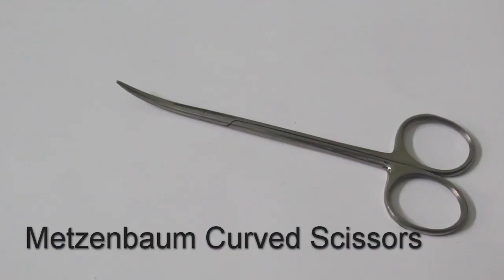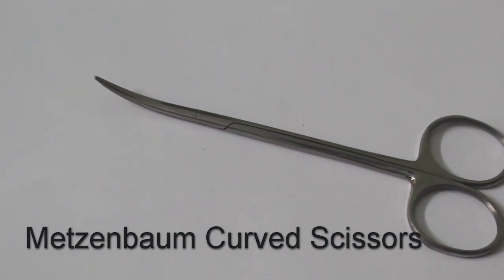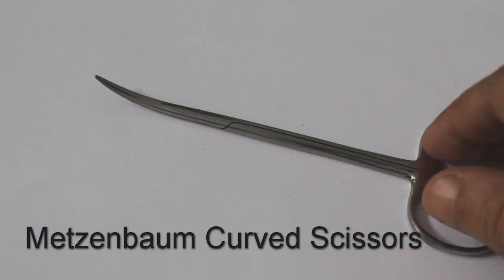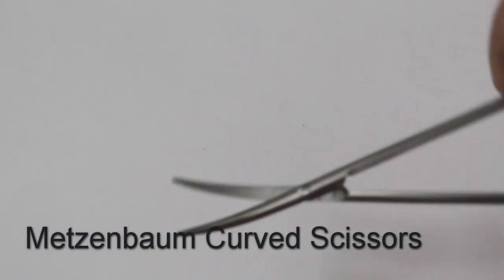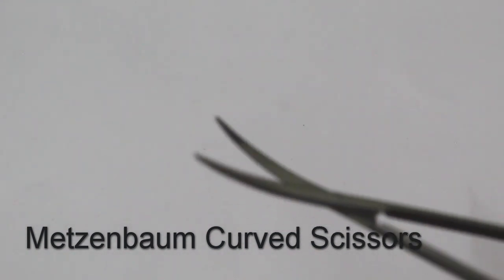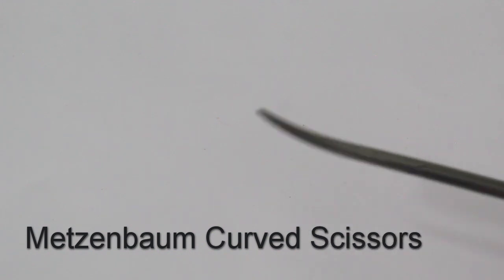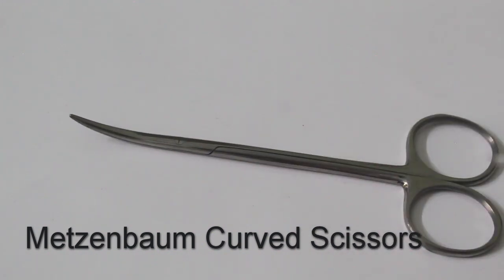Maxenbaum super cut scissors are used to cut tissue and suture materials. They have a long handle which permits working in deep tissue. The scissor blades are wide-opening, making it very easy to work in deeper tissue without affecting visibility. This one has a curved tip, but straight-tip versions are also available.